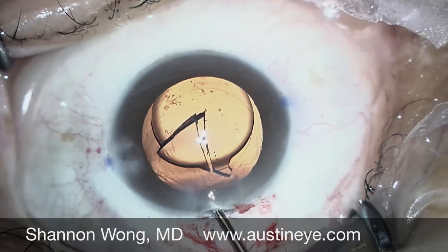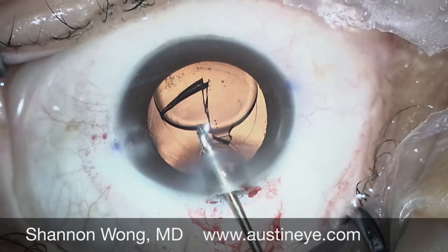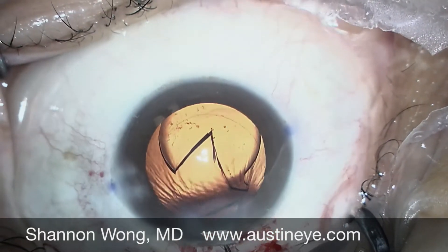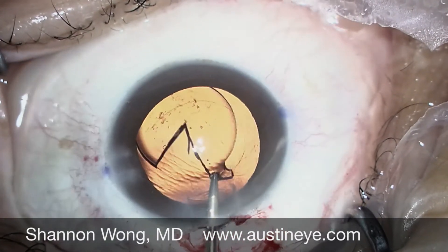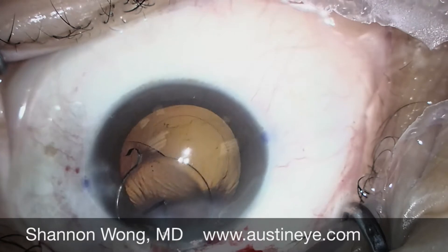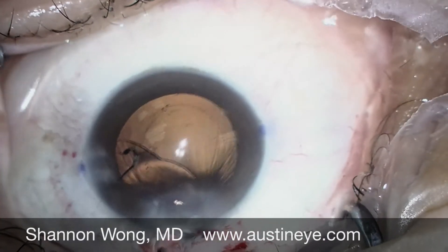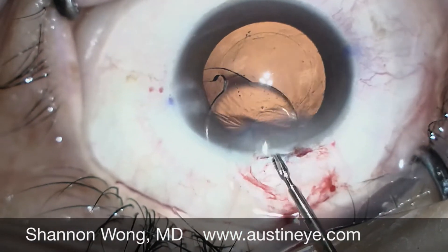Once we remove this one piece of the lens, we're able to remove the entire lens through the original primary incision without having to widen our primary incision. We simply rotate the lens implant, which is held by our IOL graspers, in a clockwise manner.